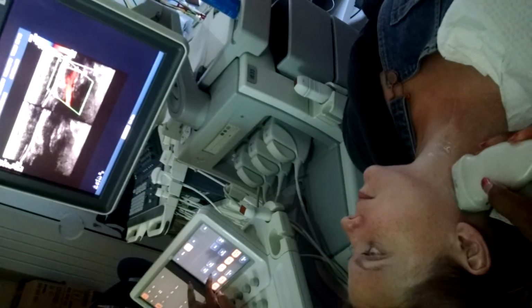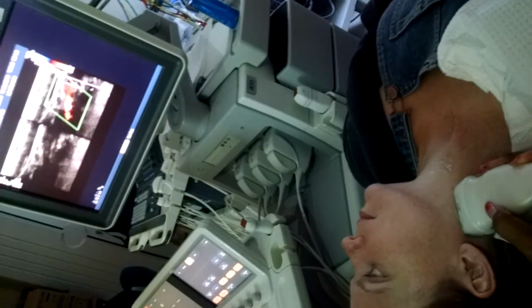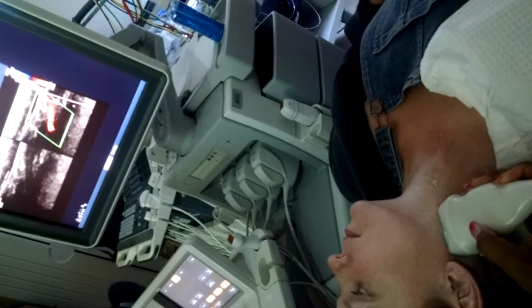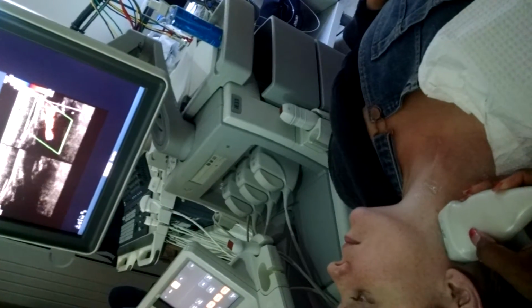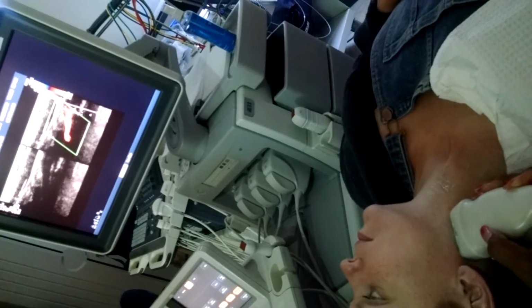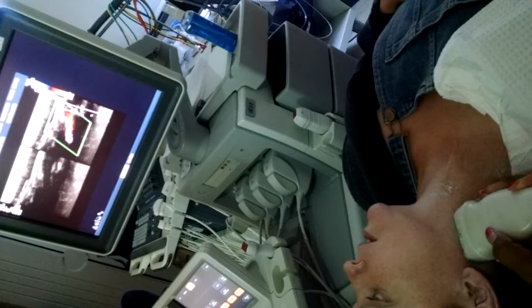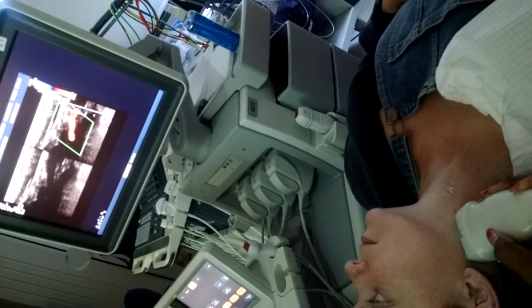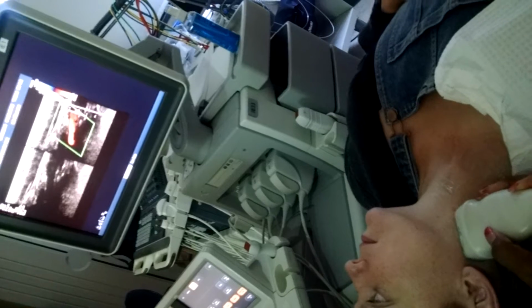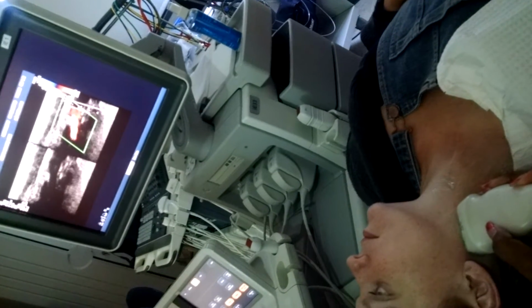Oh, okay. So there's my ICA. And see, the B mode's not optimized, so it's not the best. So you may want to take one picture of your B mode and one picture of your color, just depending on your patient. So color compare only if it looks pretty. If it's readable. Yeah, if I can actually see it. That's not bad, but it's not ideal.